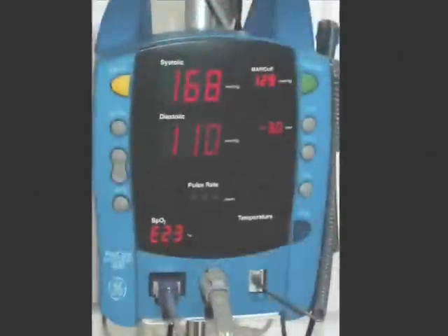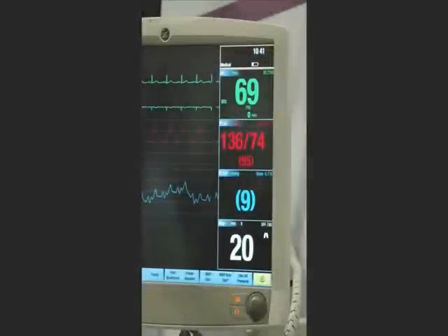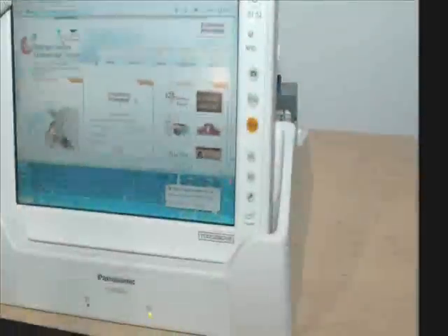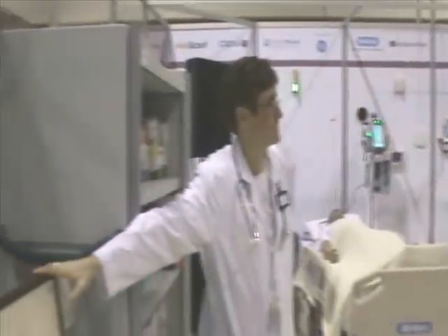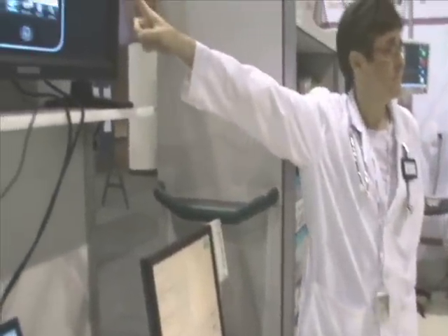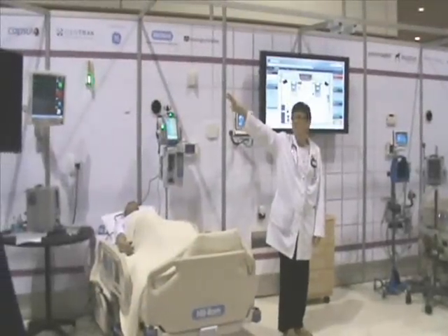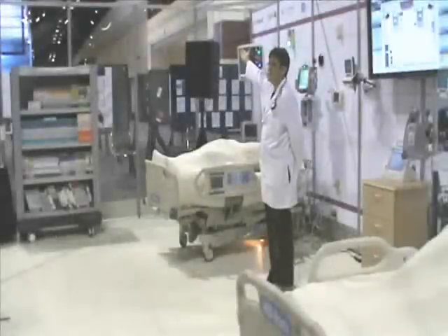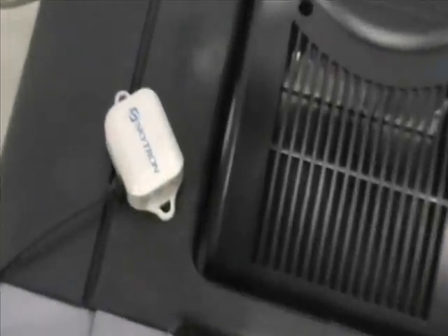The patient environment is integrated with real-time location from multiple RFID systems. The RFID information can be seen on the large monitor, portable tablet, or handheld device. Our room simulates a traditional nursing station equipped with the nurse call central station and an RFID-coupled asset management database. This monitor duplicates what's seen on the handheld devices. We also have special RFID tags capable of providing humidity and temperature information, either at the room level or at the device level, such as for a refrigerator or freezer.